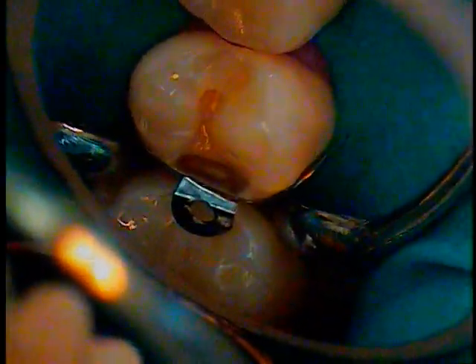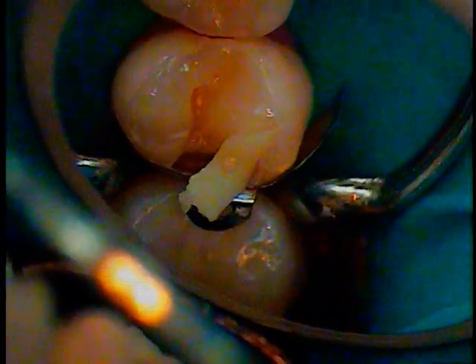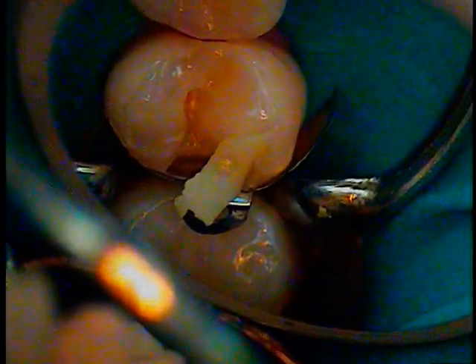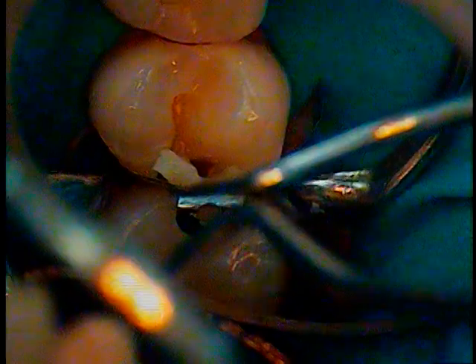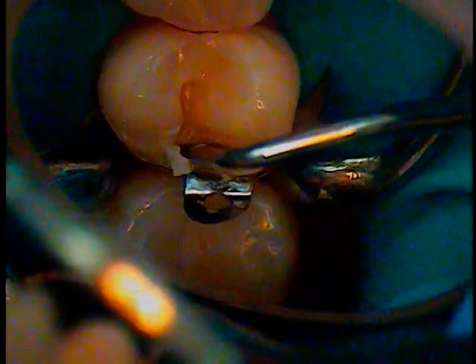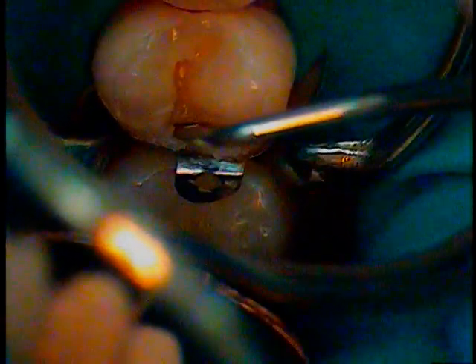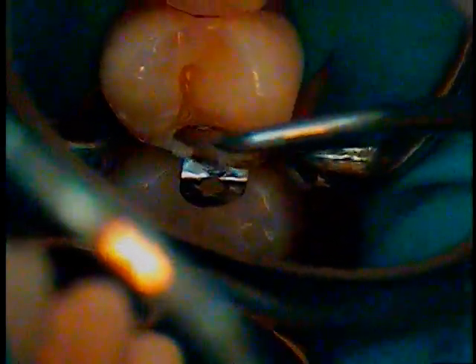So now I'm way in there. I got to have that Hollenbeck again. Okay, I'm going to cure this another layer. It's going to go a little further deeper now. So in it goes. Now you can see how I didn't go in any way, shape, or form vertically when I was condensing that first one. I went laterally. I'll do it again.